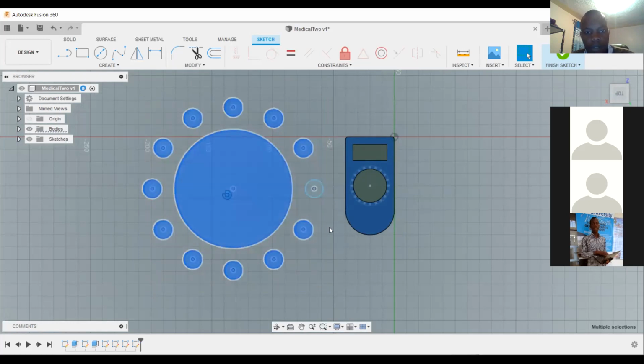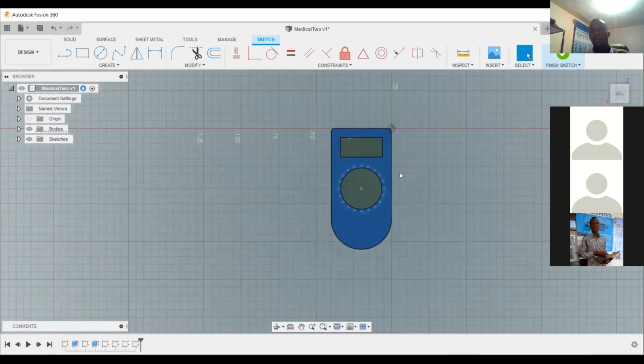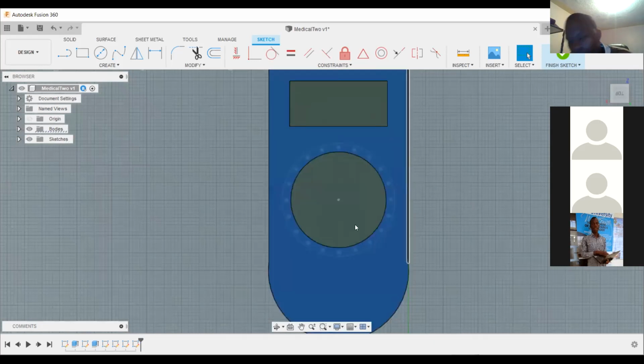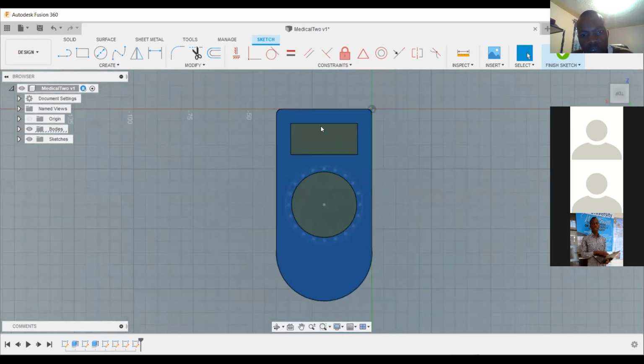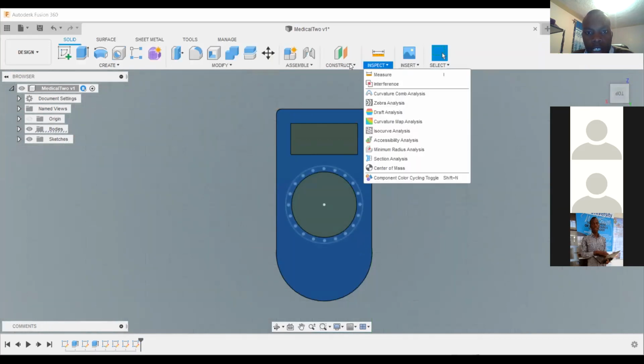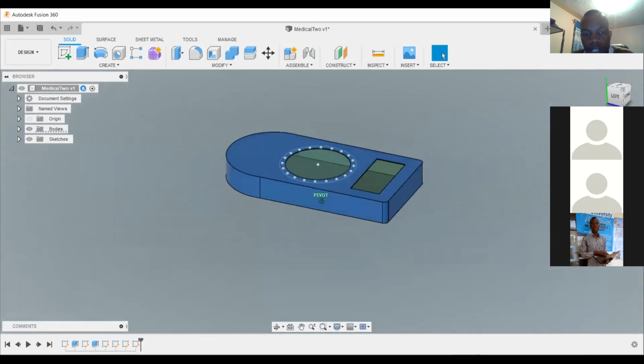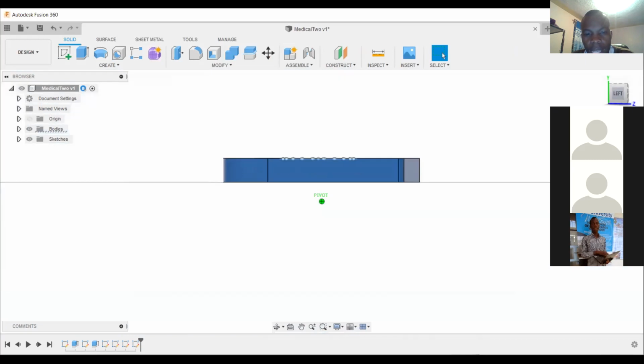So I'm going to delete them because we are not using them. Okay, so we've done that. So we want to split this shape. You remember, you come to inspect, you come to construct. We want to split it, meaning, or let me just show you. So iko hivi. That is how it's looking like on the side. So we want to split it. It's an assembly. Like huko nyuma, there is where you put the battery.